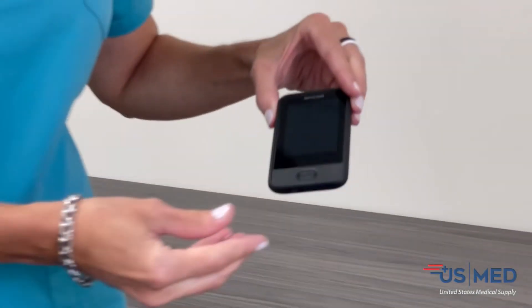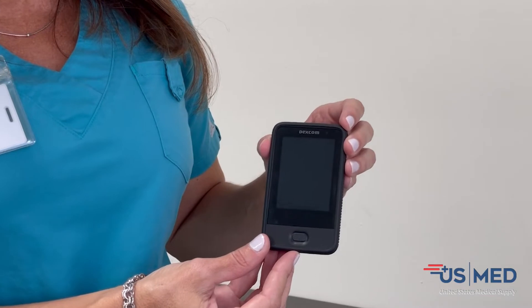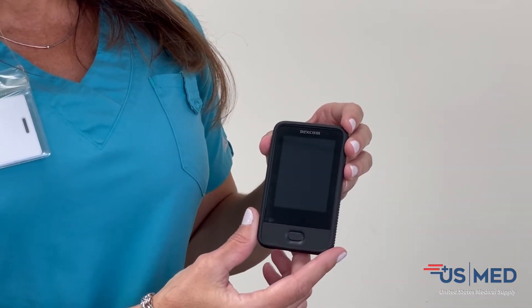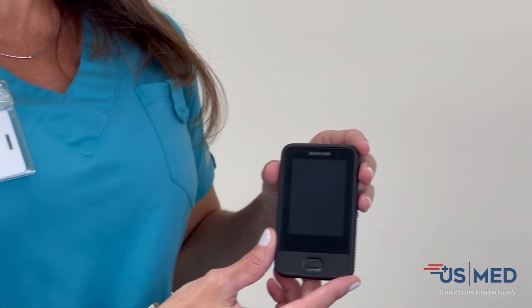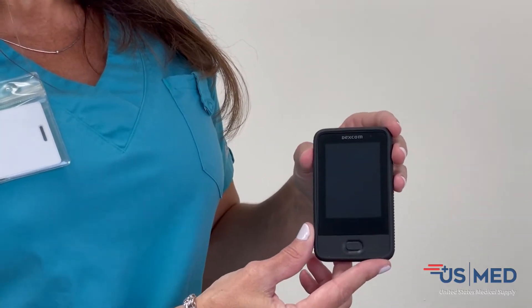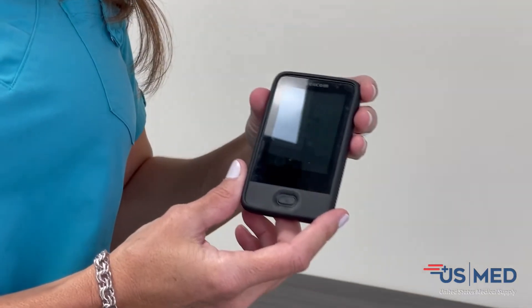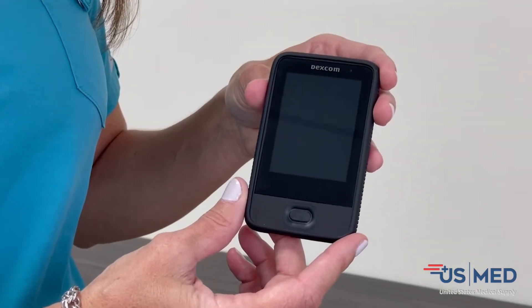Here is the Dexcom receiver. It's a touch screen, very easy to use. You can set up the Dexcom G6 with your receiver or with the smartphone — Apple or Android — but you would have to set up one device at a time. Some people prefer to use their phones, but either way you can have both of them connected.